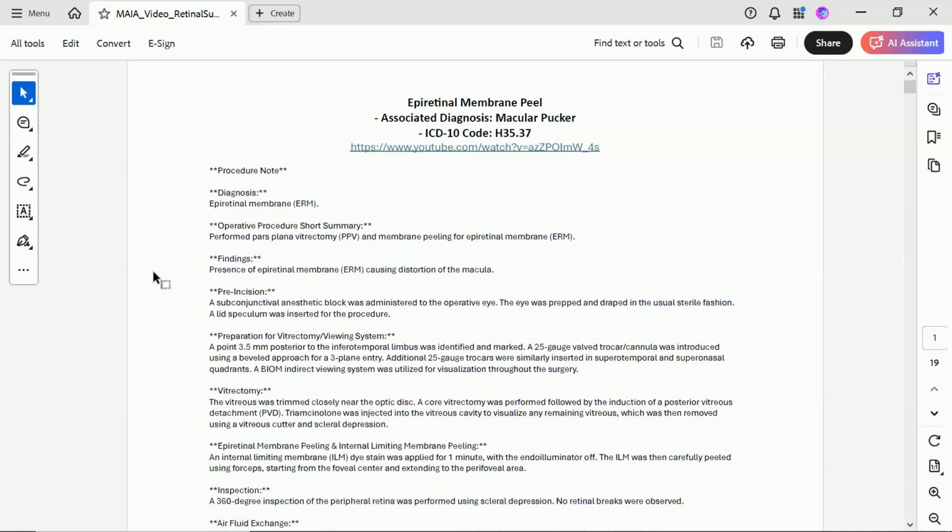So we feed it the full procedures. We feed it reference clips of specific things being done in those procedures, and then we feed the AI the corresponding op notes. And we essentially train the AI on those procedures so that it understands what's happening. It's able to accurately output this information, and it's able to identify what is being done so that it can pull up these reference clips in real time.